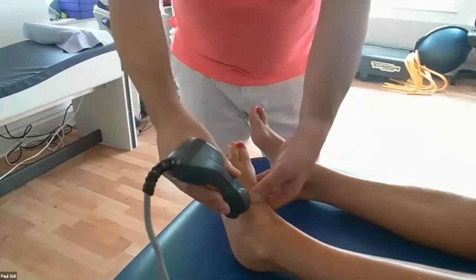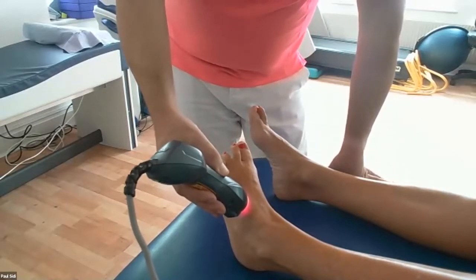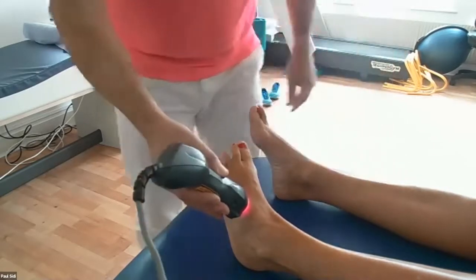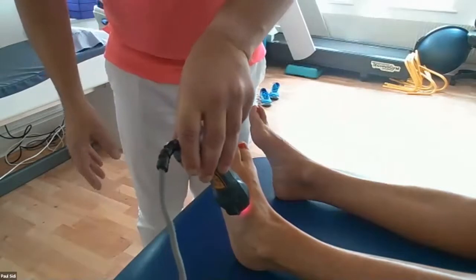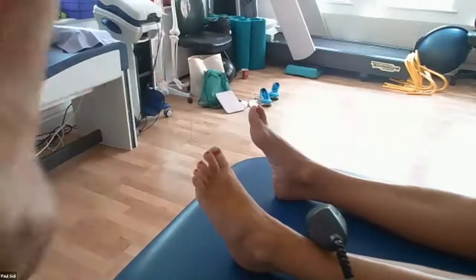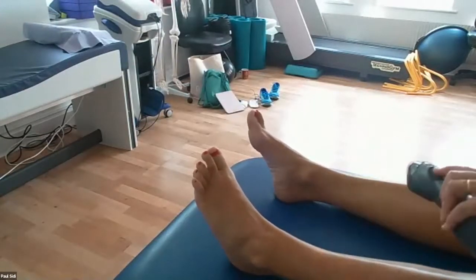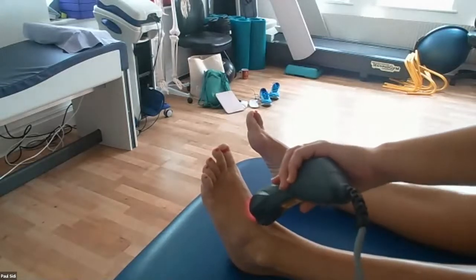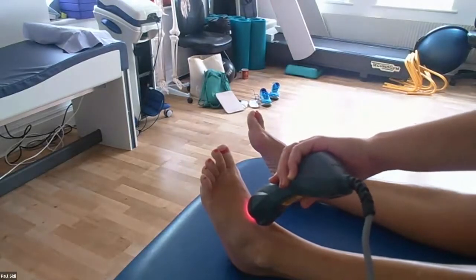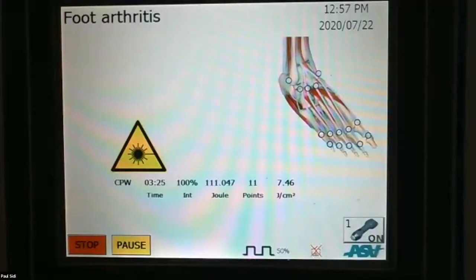We go to the next bit, next joint. We're going to go in here, feel all these areas, and so on. Let me just show you exactly what's happening on the laser itself. Going to keep that running. Oh, it stopped again. Okay, let's start again. Can you press the button on there? Right, good. You get the patient. Patients often like doing this themselves, and give them some part of their treatment. They honestly love doing this. They get very much into it.